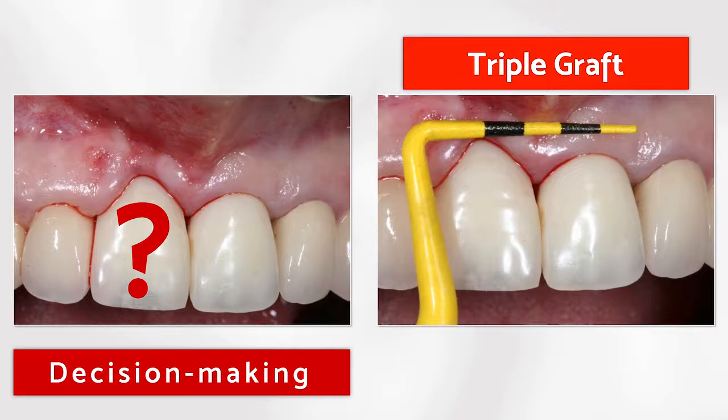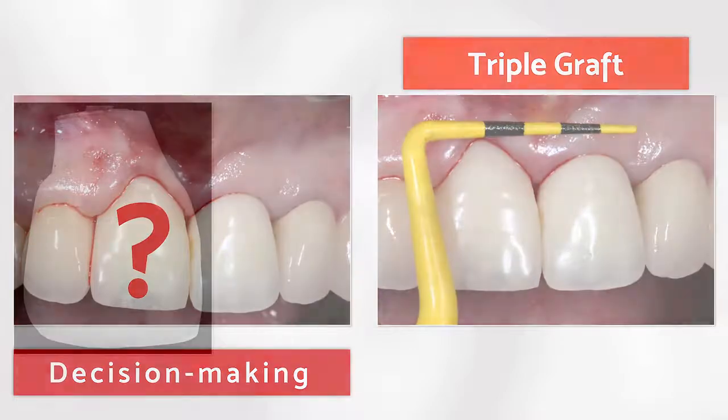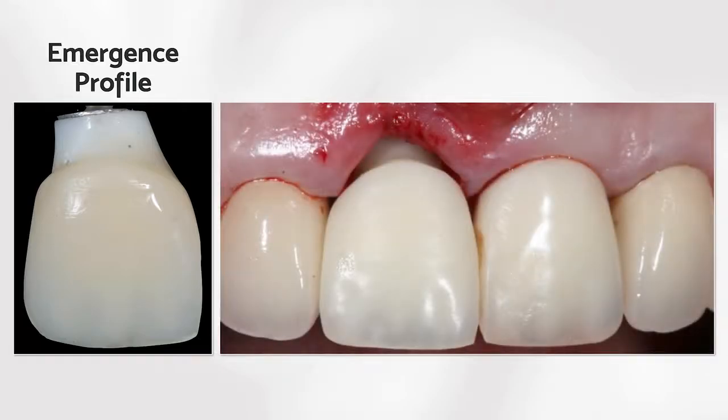Our goal here in this clinical case is just to let you know that it's possible to change the position of the soft tissue in the coronal direction when we use only bone. We manufacture the provisional restoration. Let's have a look at the emergence profile. And we install this provisional restoration regardless of the gingival recession.